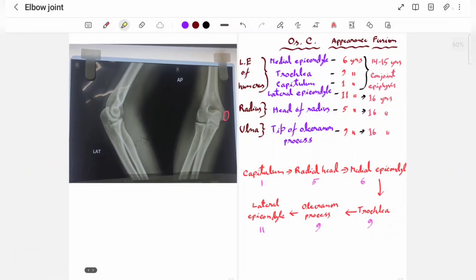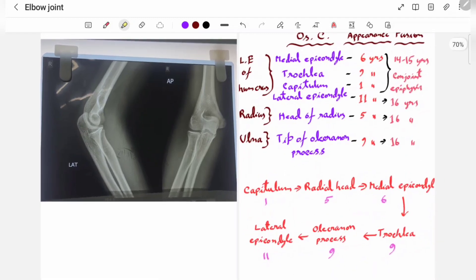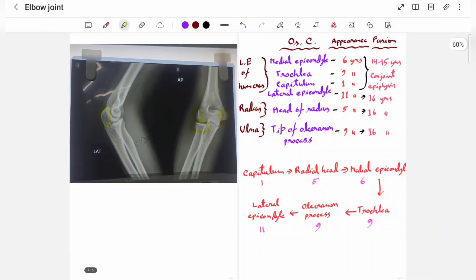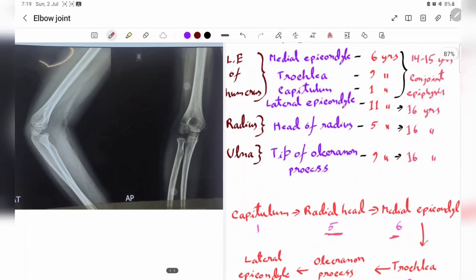Now let's look at some X-rays and try to determine the age. In this first X-ray, the medial epicondyle has already appeared and fused, the lateral epicondyle has appeared and fused, the head of the radius has appeared and fused, and the olecranon process has already appeared and fused. Since all structures have appeared and fused, the person is definitely 16 years or older.